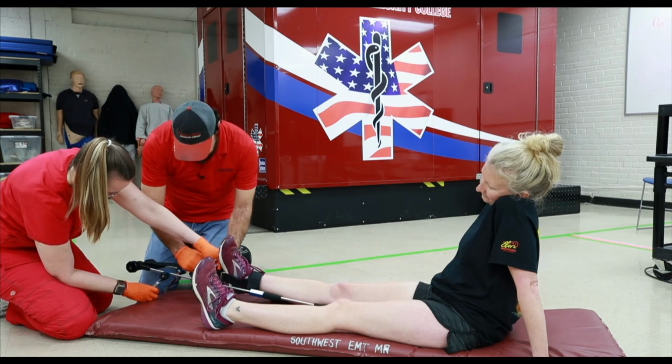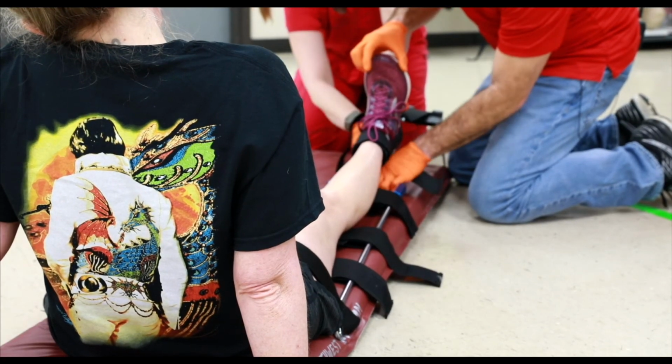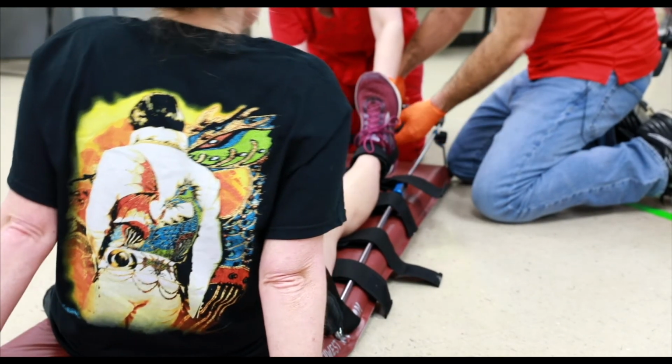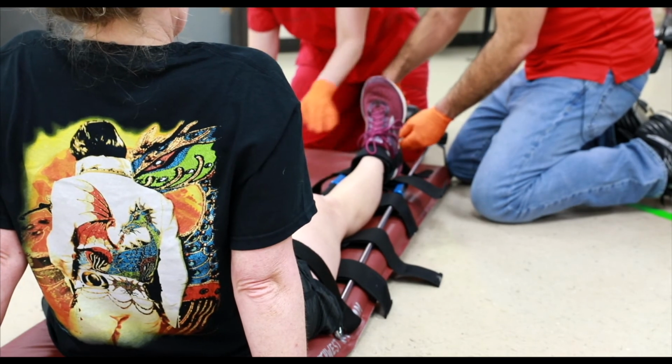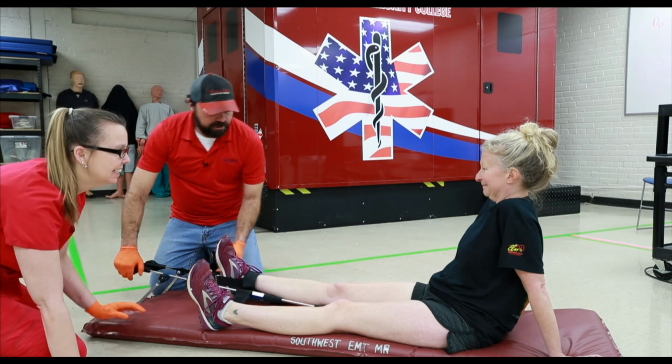All right. So you're going to connect. Make sure that your straps are underneath the leg, and you're simply going to crank till the patient tells you that they feel relief. Ma'am, does that feel okay? All right.